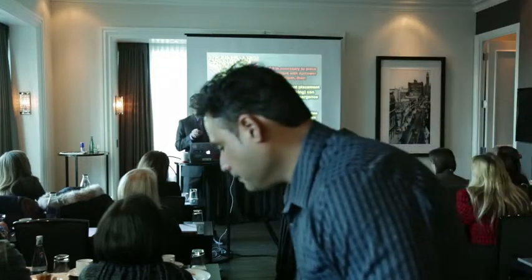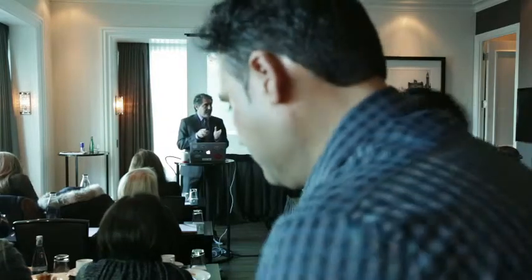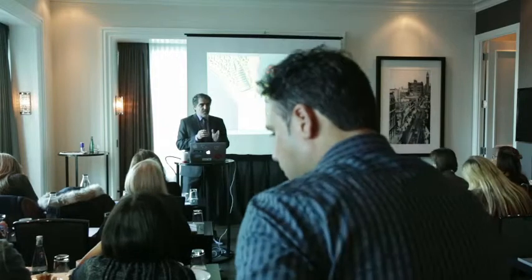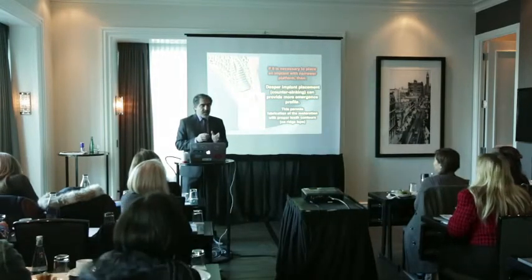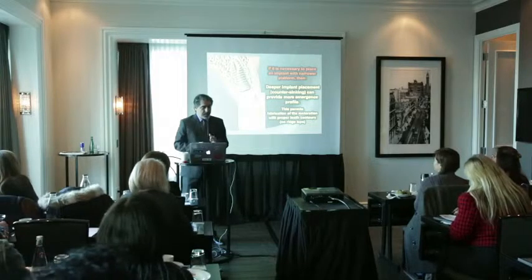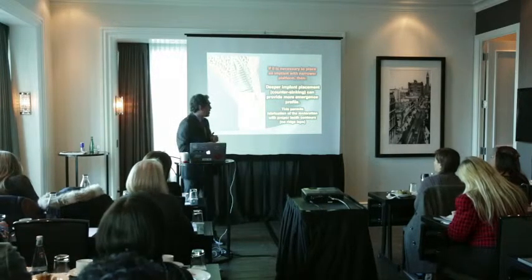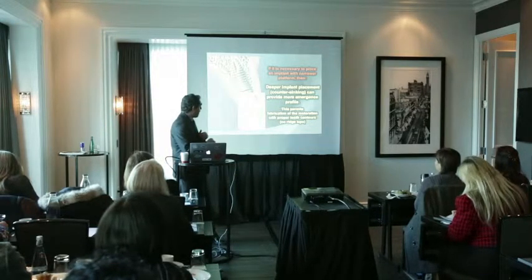Now, if a patient does not have enough bone, and the surgeon is placing the smaller implant deeper, as you can see, this triangle actually is a golden triangle. The size of the platform can be smaller as you place the implant a little bit deeper. And when you compare the two, you will see that the larger size implant, as you can see here, should be placed somewhere around here.